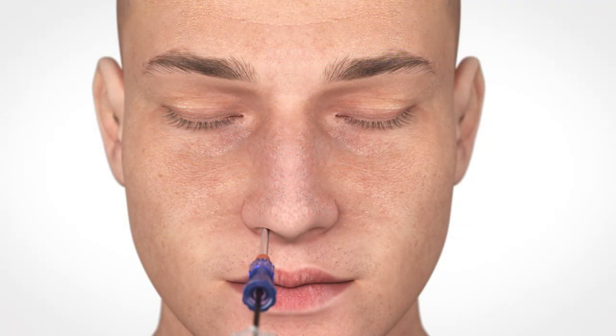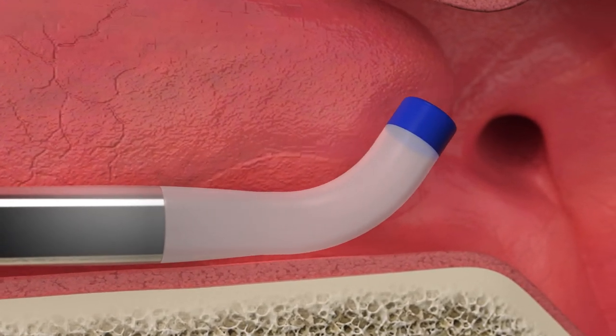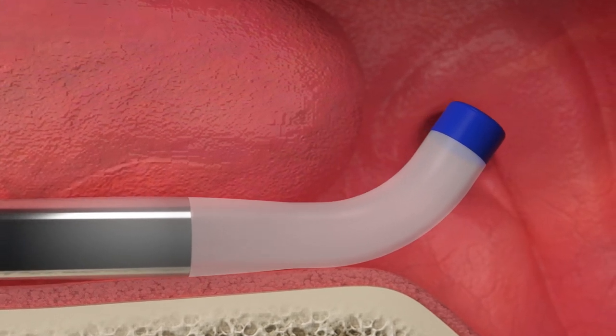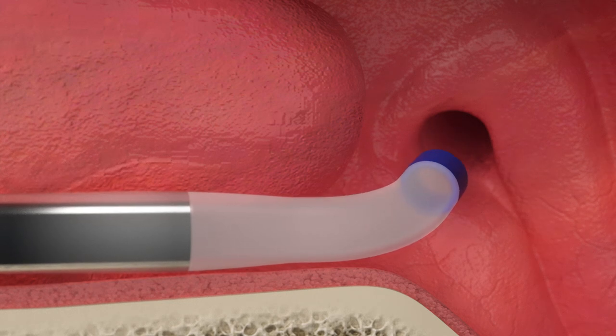Gently insert the guide catheter into and along the base of the nose. Acclarent AERA preserves the natural anatomy with minimally invasive transnasal access. Rotate the guide catheter so that the tip angle is aligned with the trajectory of the eustachian tube.